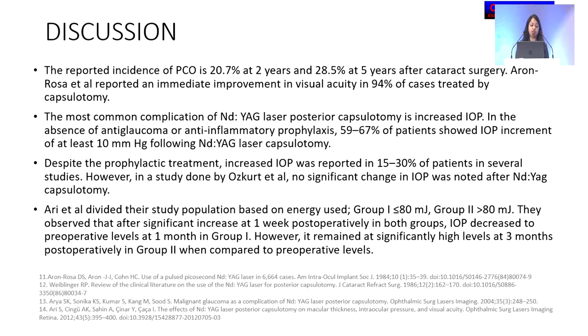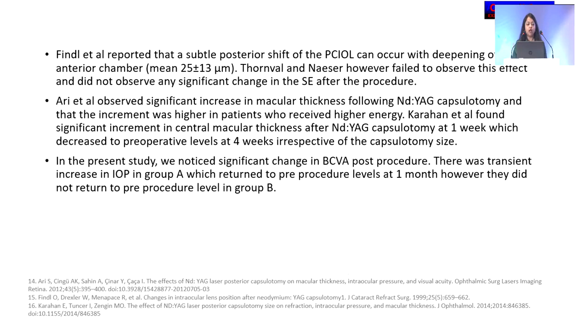Another similar study by Eri et al. divided the groups according to the energy used as less than 80 millijoules and more than 80 millijoules, and they reported similar outcomes. Now, Findl et al. reported a subtle posterior shift of the PCIOL occurring along with deepening of the anterior chamber. However, in other studies, they failed to observe this effect. Ari et al. also noted significant increase in the macular thickness following Nd:YAG laser posterior capsulotomy, and the increment was higher in patients who received higher energy.